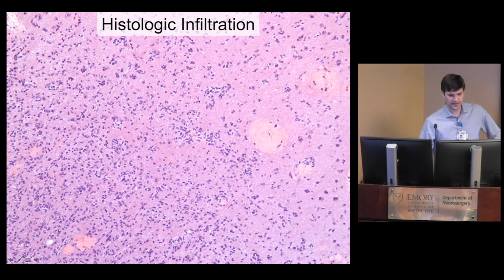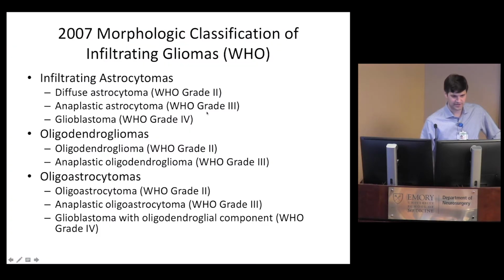And you can see that they do group up around other cells. So here's a few neurons in this section, and you can see that these tumor cells, you see most of them down here, but you can see that the tumor cells are grouping up around the neurons, that perineuronal satellitosis. And here it is around a vessel, and so forth. So those are the secondary structures.